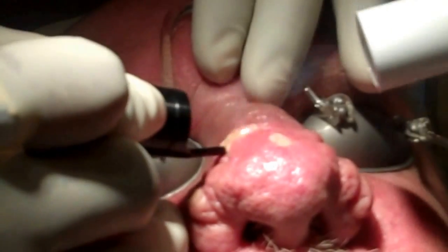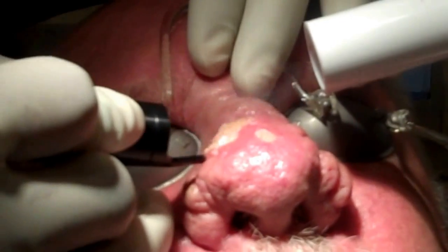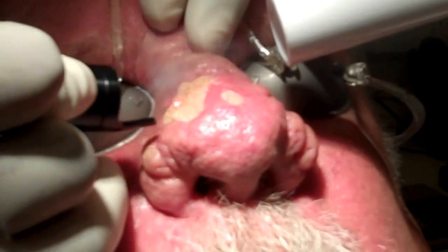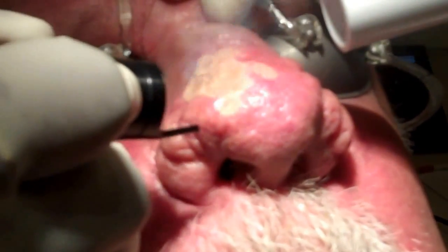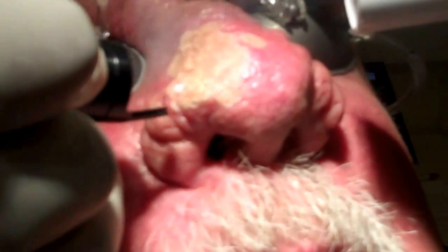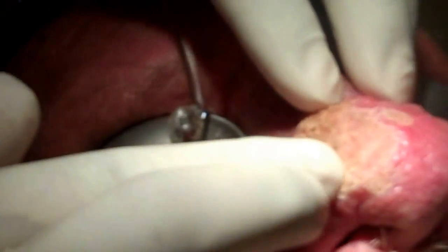And here we start the resurfacing process. Slowly but surely we're taking away the lobules — the sebaceous lobules which contain the sebaceous glands and the sebaceous discharge. It may be evident on a close-up: when we try and squeeze these, you can see the sebaceous discharge coming out of these lobules. So that means we are in the safe zone.